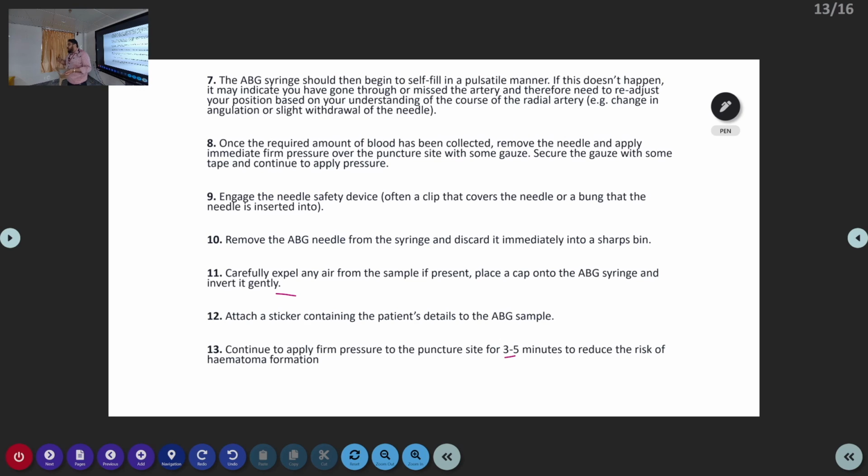You have to withdraw the needle and take a cotton swab and give firm compression. After that, you can cover that area with a tape, and make sure that firm pressure is continued for approximately 3 to 5 minutes. What is the next thing you have to do?